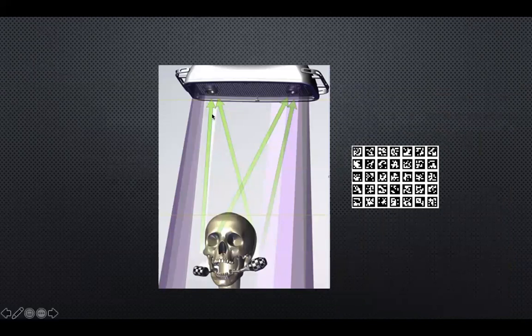So how does it work? Basically and simply, there is a tracker that is attached to the patient, and another tracker that is attached to the handpiece. And on these trackers, there is fiducial marking that looks like this. So this big camera here sends infrared lights that is reflected from here and then picked up by these cameras.